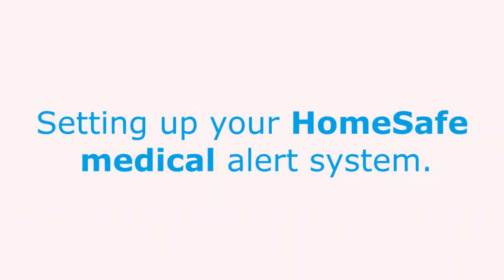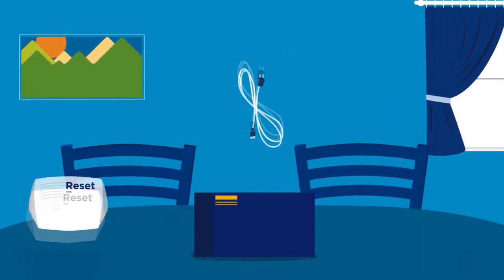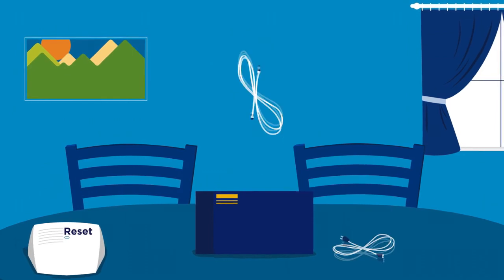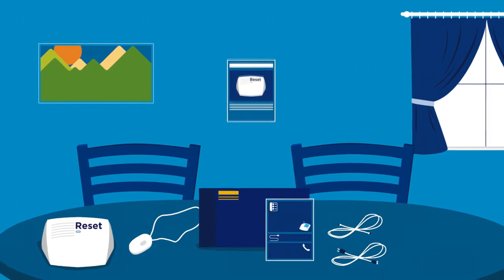Let's take a look at how to set up your HomeSafe Medical Alert System. When you unpack the box, you should have the home communicator, a power cord, a phone cable, a help button, a quick start guide and a manual.